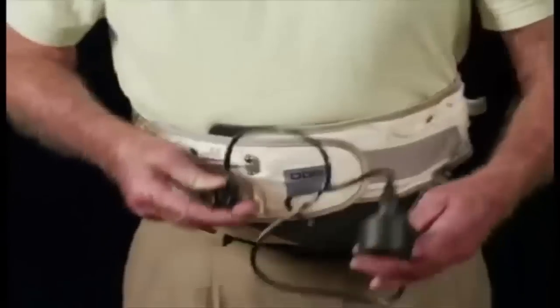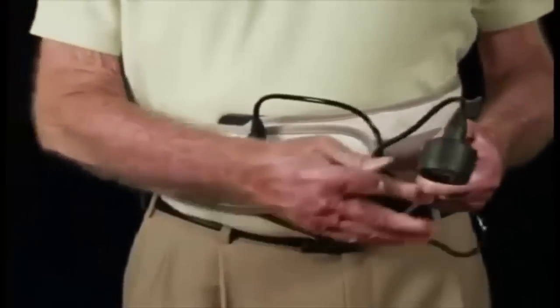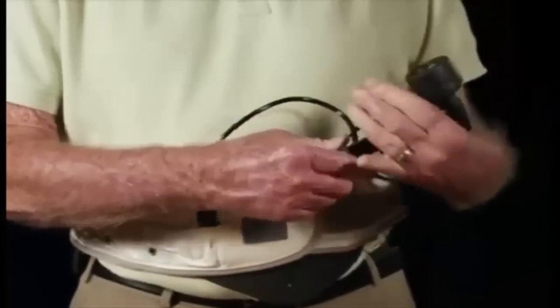Step 4. Now connect the hand air pump to the air valve. Make sure to connect the air injection tongs exactly with the air valve as shown.